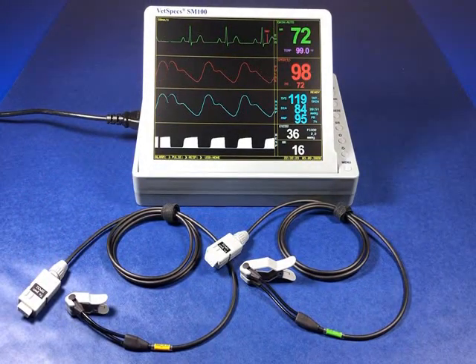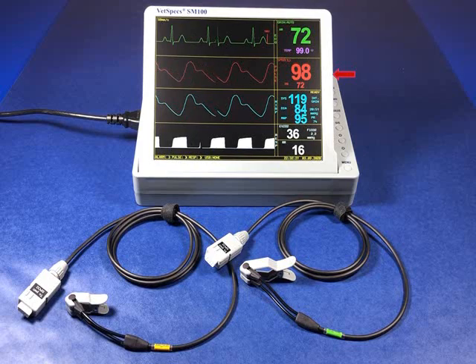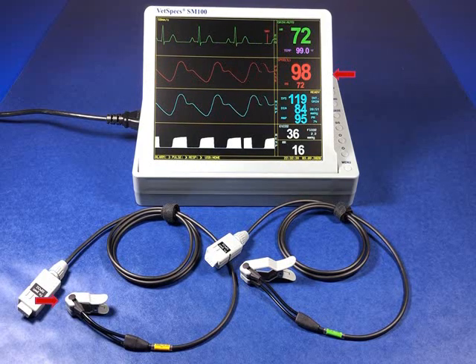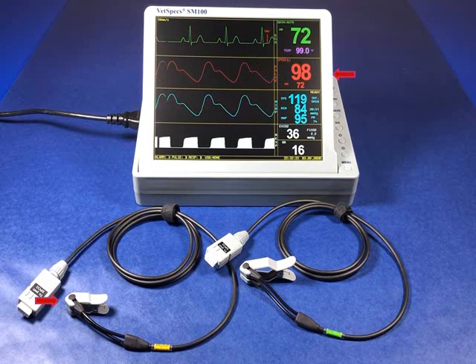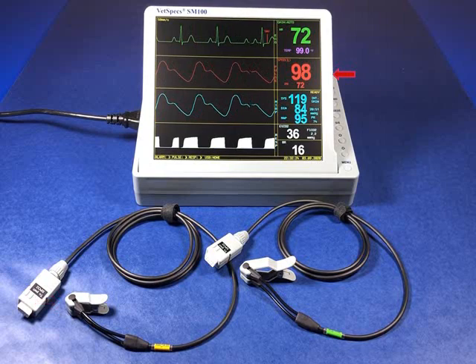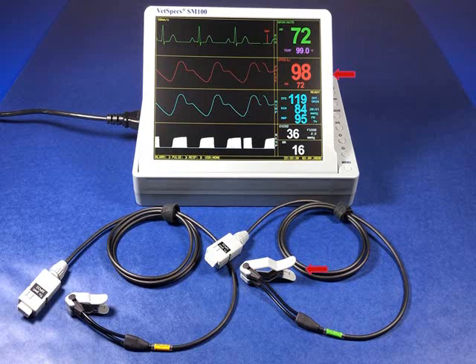Along with every SM100, VetSpecs includes two different clip sensors for our digital pulse oximetry. The first is our lingual sensor, which mindfully incorporates a slightly smaller clip containing a hinge spring with the ideal tension for use on a patient's tongue. Opposite of our lingual sensor is our leg paw sensor, containing a larger clip with stronger spring tension for connection to distal areas of the patient's body.